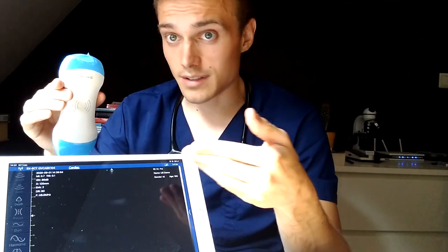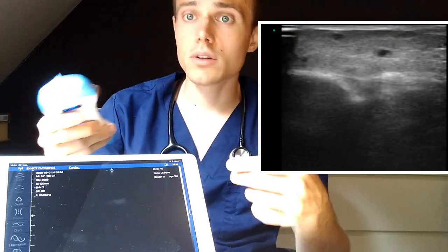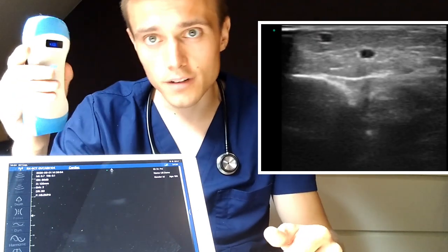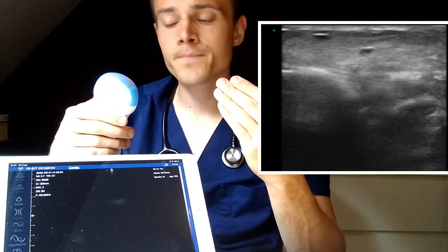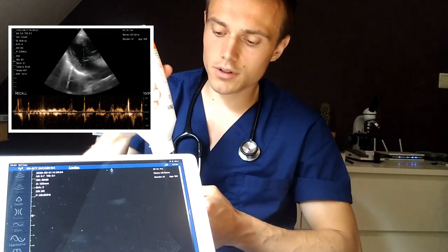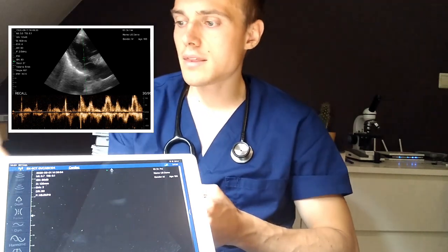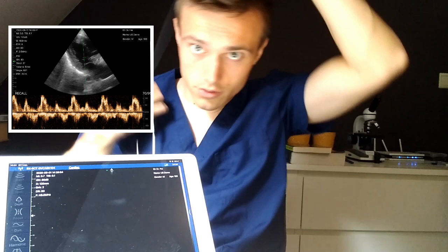All we need is a wireless probe, we have any tablet or smartphone which can take Android or iOS applications. We install a certain app, we connect our probe, it generates a Wi-Fi signal of anything it images. So then we apply some gel to the transducer, and then we can start imaging. I'll show you now.